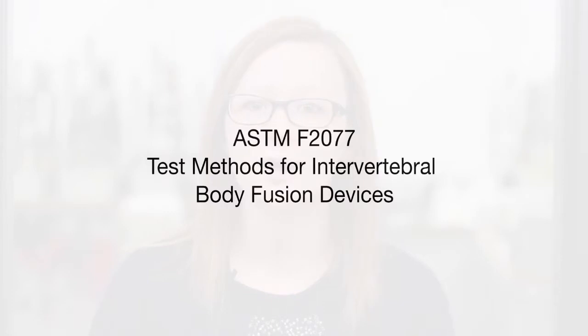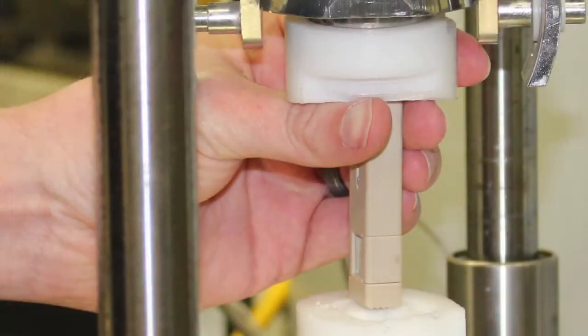The first type of testing we'll cover, static and dynamic construct testing, is typically performed in accordance with ASTM F2077, test methods for intervertebral body fusion devices. ASTM F2077 is used to provide a standard comparison to a predicate device. The test program contains compression, shear, and torsion tests. Testing should consist of 6 of the worst-case construct for both static and dynamic testing, as identified previously in our discussion. For static testing, the construct is loaded between stainless steel test blocks. For dynamic testing, it's loaded between polyacetal test blocks.